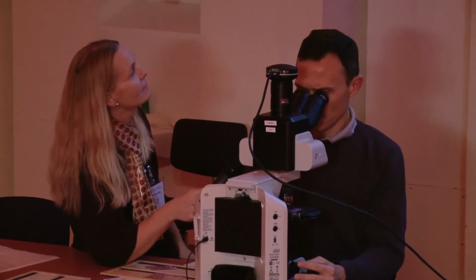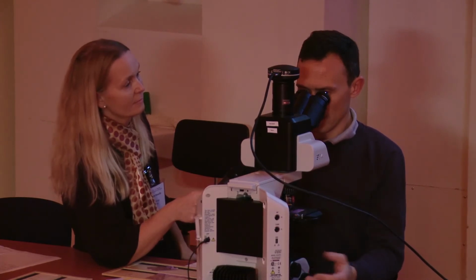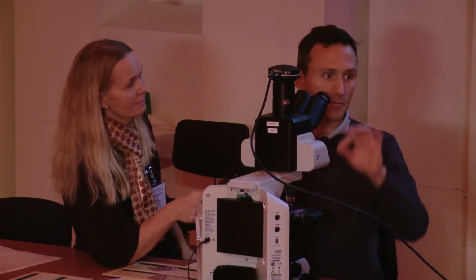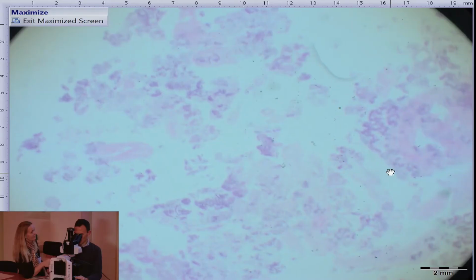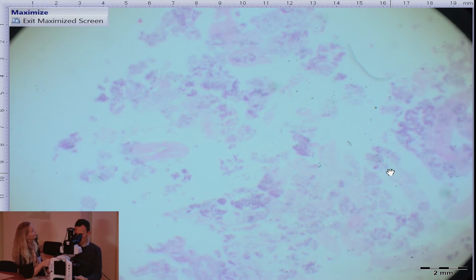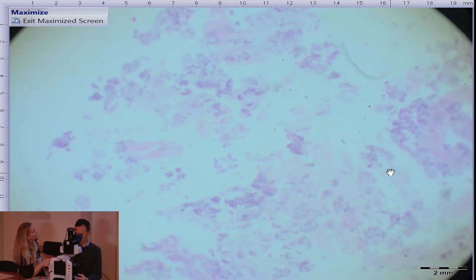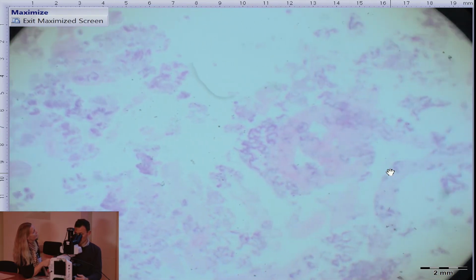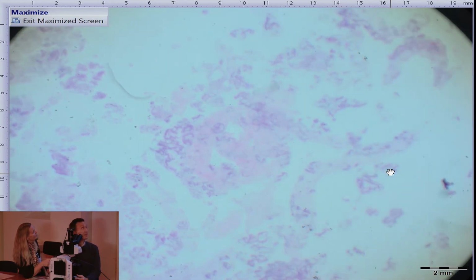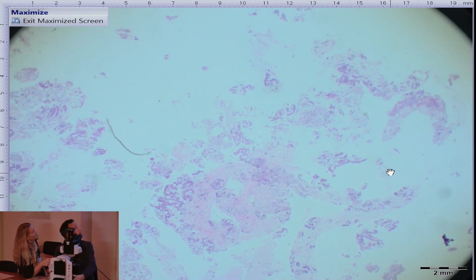Okay, and we received some macroscopically what looked like fine needle biopsies, thread-like tissue elements suspended in CytoLyt, and we made cell block histology specimens from those materials, and they have proven to be of a high quality and very rich in cells. Let me just focus this for you. Just scanning through one of the specimens.